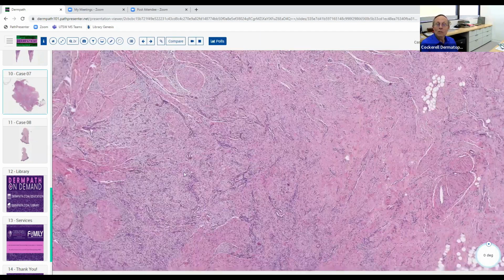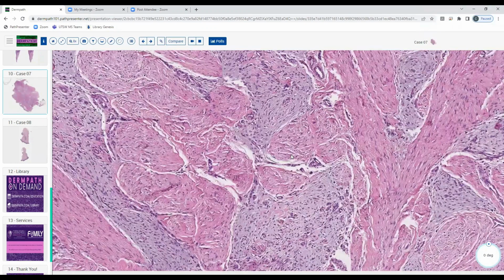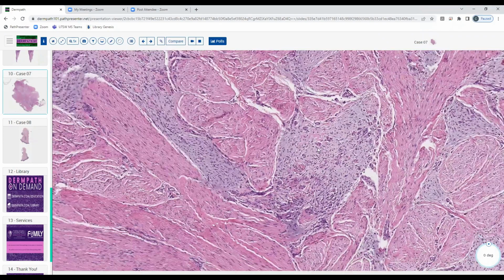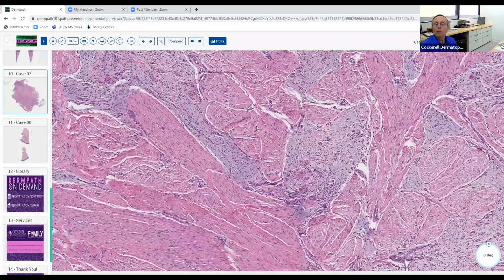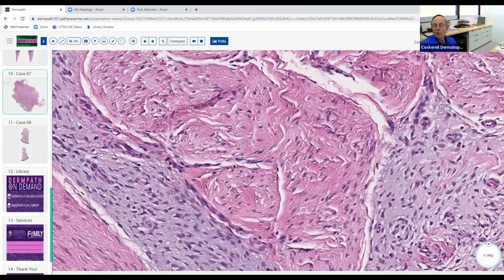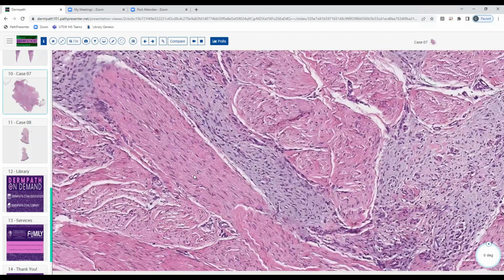So what's the diagnosis? The cigar shape makes me think of a leiomyoma. But that was just showing the cigar shape in the blood vessel. So here we're over in the fibroblast category. If it's a fibroblast mostly lesion with lots of collagen, call that a spindle cell lipoma, maybe?